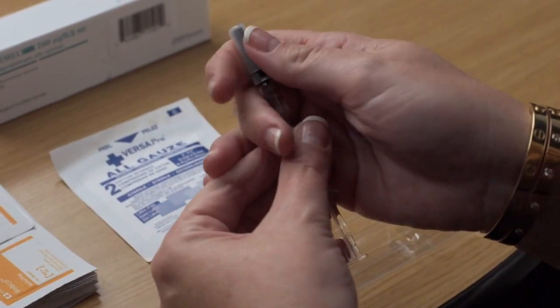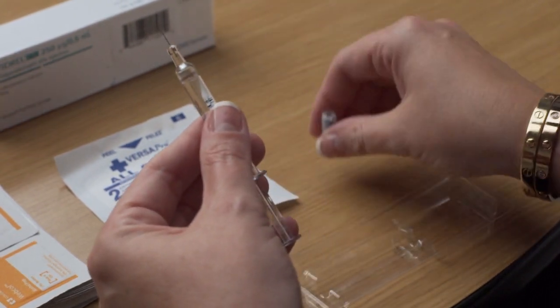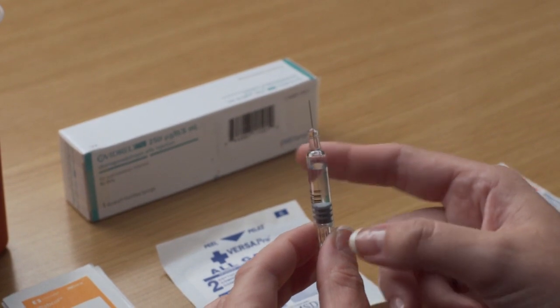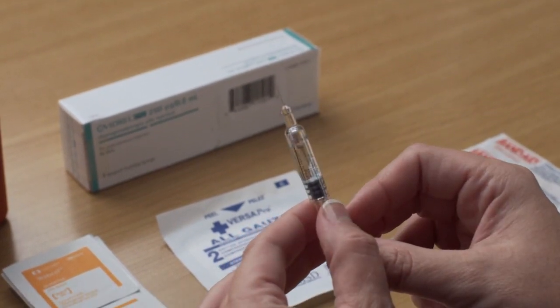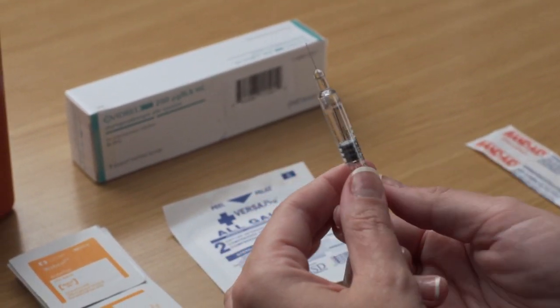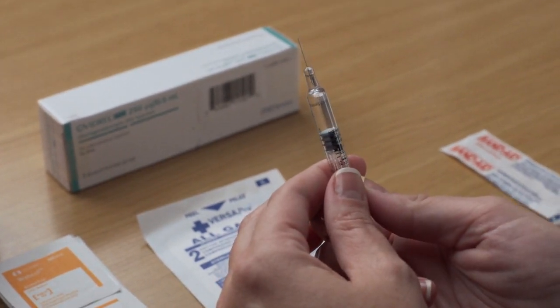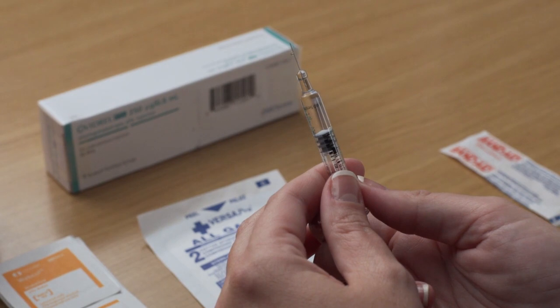Carefully remove the needle cap from the syringe. Do not touch the needle or allow it to touch any surface. To remove any air bubbles, point the needle up and gently tap on the syringe until all of the air bubbles rise to the top. Push the plunger carefully until a small drop of liquid begins to appear at the tip of the needle.